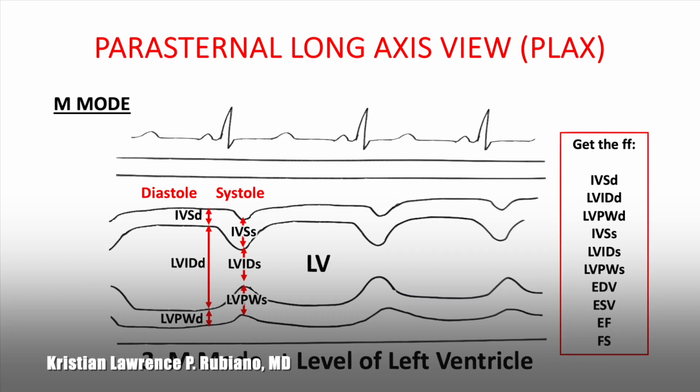It reflects the volume status of the heart and its ability to manage preload. Left ventricular ejection fraction, or LVEF, is a crucial measurement used to assess the function of the left ventricle of the heart. It quantifies the percentage of blood that is pumped out of the left ventricle with each heartbeat. Typically, values higher than 55% are considered normal. Values less than 55% may indicate impaired systolic function, while values below 40% are often associated with significant heart dysfunction and may warrant further investigation or treatment.